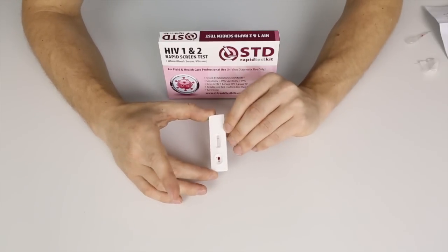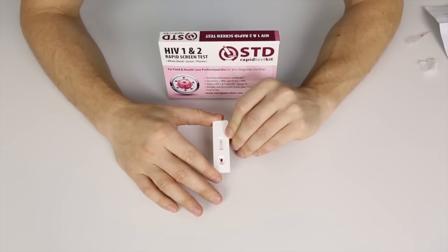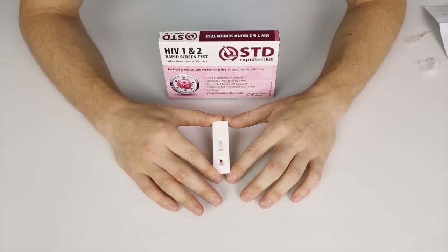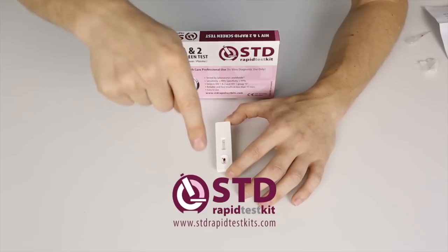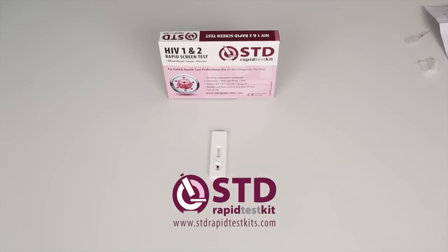Here we can see that there is only one line next to the C, which indicates that I am HIV negative. However, if the line had shown up next to the T as well as the C, that would have meant a positive result. If you use this test and it comes up with a positive result, it is very important that you immediately seek out professional advice — go to a doctor, talk to them about your situation, and have them perform another test. Thank you everyone for watching. We have a website at www.stdrapidtestkits.com where you can buy a rapid test kit for HIV. Goodbye.